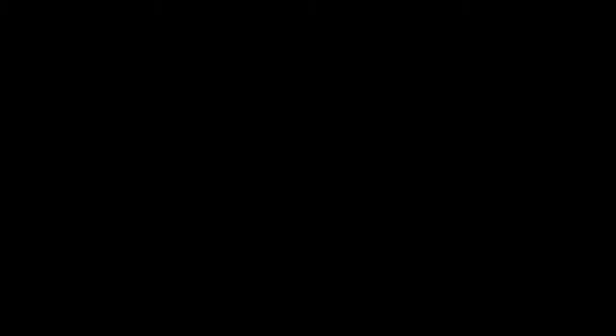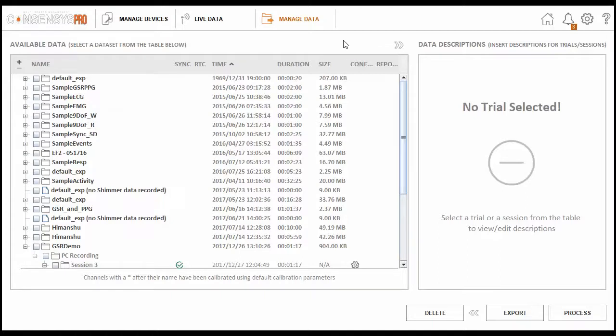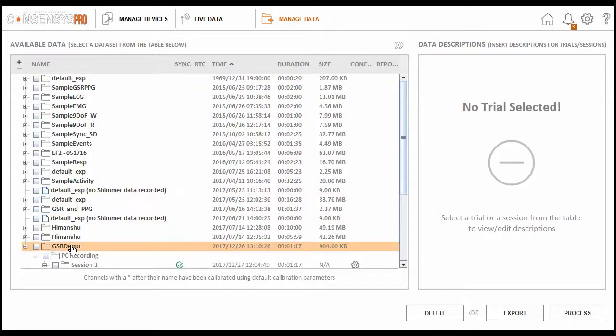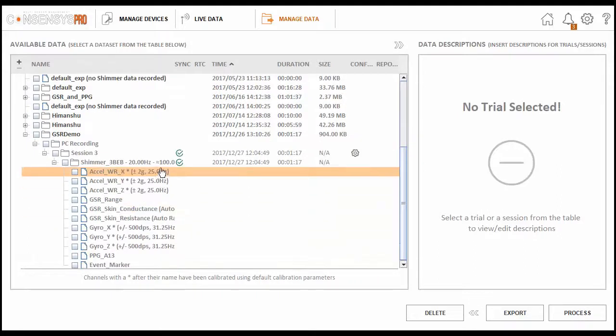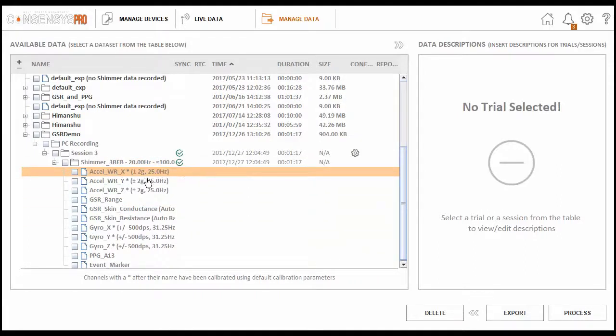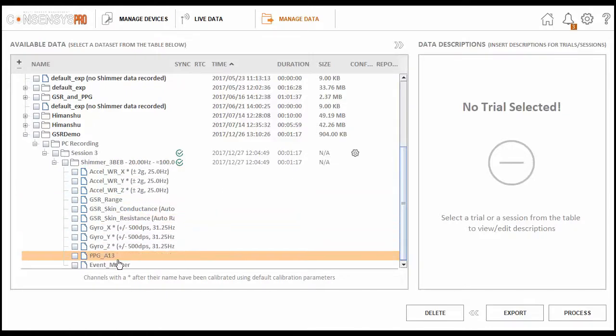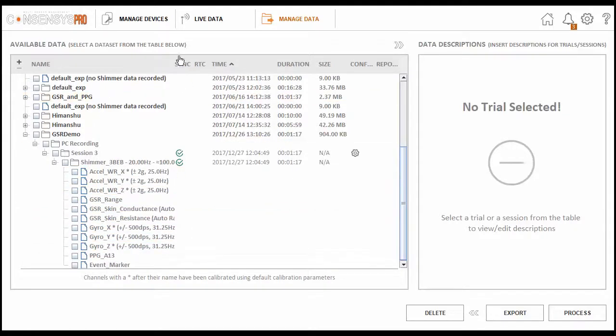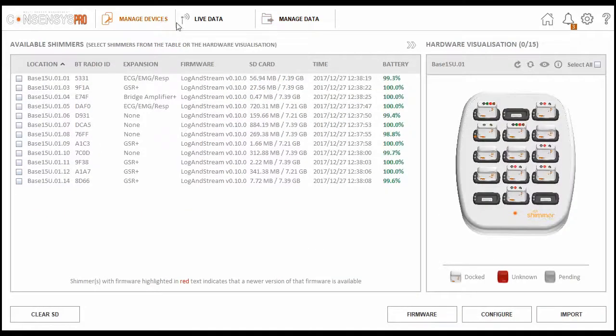So I've now completed collecting data for this demo. The next step is to retrieve the data. Firstly, the live stream data is automatically saved onto the local database. I can see this in managed data under the trial name I set earlier, GSR demo. We can see here the transmission rate was very high, with little to no dropped packets. We can also see the various signals we collected.